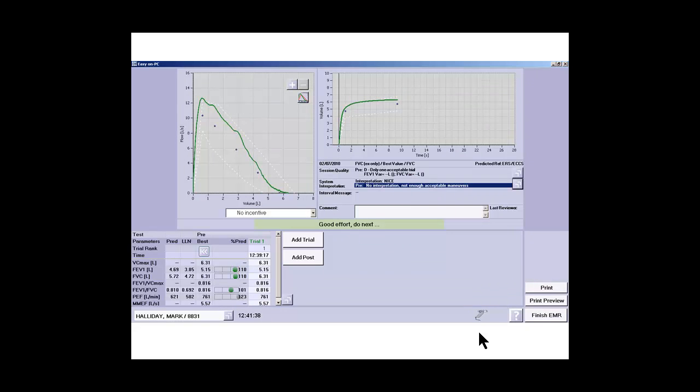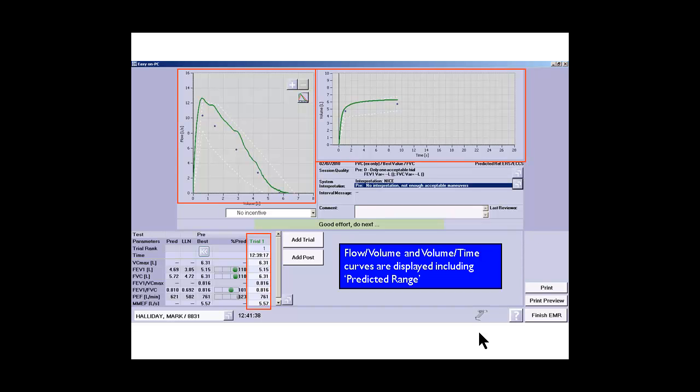So this is the first test. The patient has performed the blow and you can see the flow volume loop on the left side and the volume time graph. It's telling us that it was a good effort this particular blow. You can see the results now building up on trial one.